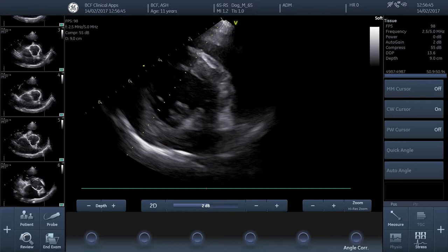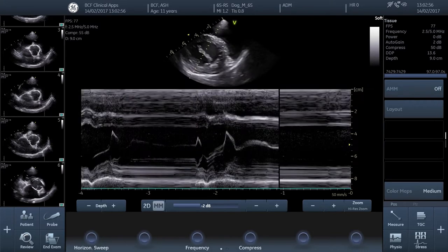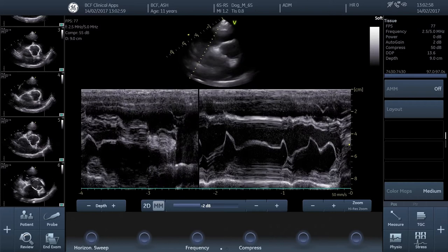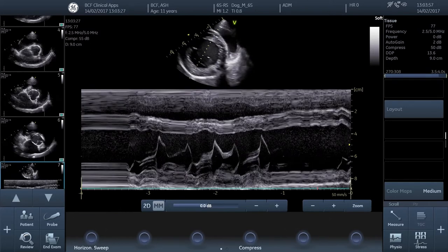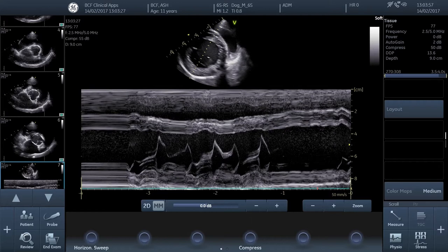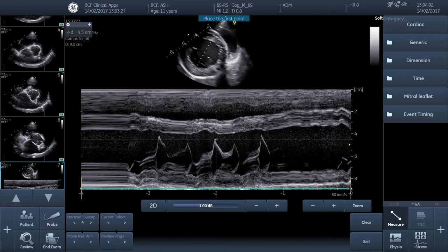Once we're happy with the position of the cursor, we can activate Live M-Mode, and then allow several cardiac cycles to pass before saving a cine loop. What we want to see is clearly defined traces of the interventricular septum, the mitral valve leaflets, and the left ventricular free wall, as well as the left ventricular lumen. Once we're happy with our stored cine loop, we can go ahead and make our EPSS measurement.